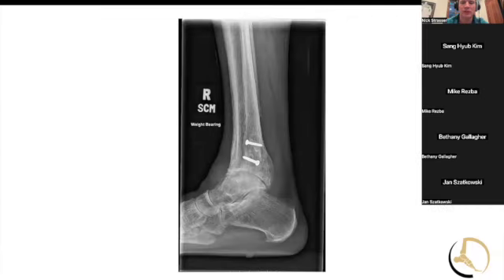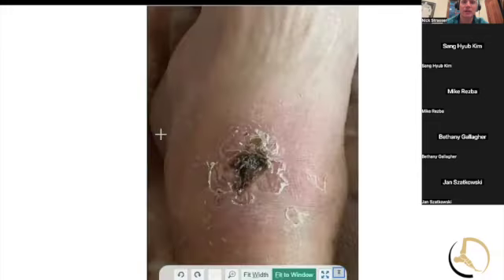So I did a little exostectomy out the front, but sure enough, that anterior medial wound with no hardware underneath it did just terrible. It took forever to heal. It got a big scab. I think it took a month or two to fully heal. So in my mind, that was enough of a test that I thought, okay, I don't want to go through that again. And so now what?